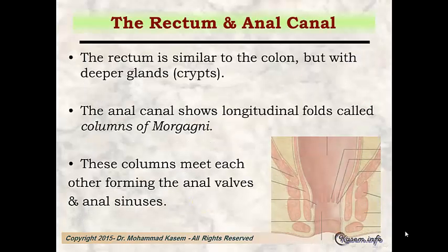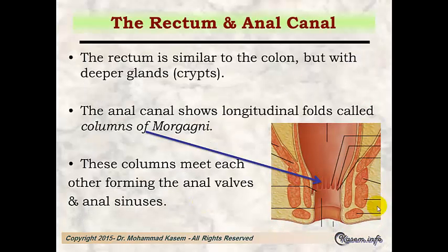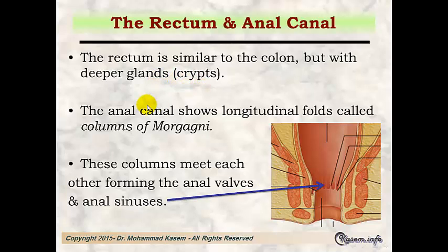The rectum and the anal canal. The rectum is similar to the colon, but has deeper glands or crypts. The anal canal shows longitudinal folds called columns of Morgagni.